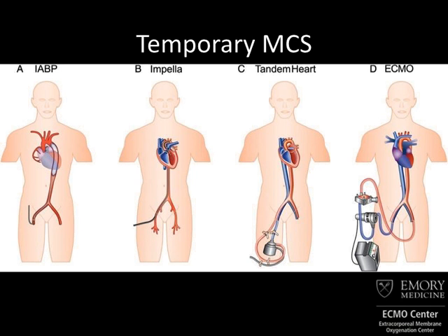So I'd like to move the conversation now and focus on cardiac support of ECMO or with ECMO. And I think it's important to think about cardiac support in a spectrum and where ECMO falls into this. So what you see here is currently the technologies that are available in the US for the treatment of mechanical circulatory support. There's the intra-aortic balloon pump, which has existed for a long time, and I will talk a little bit about that. And then there are two devices that are primarily designed for left heart support. One's called the Impella, one's called the Tandem Heart. Both are percutaneous in their placement. The Impella just runs up the femoral artery and hangs out in the LVOT and pumps blood. The pump is actually right here.